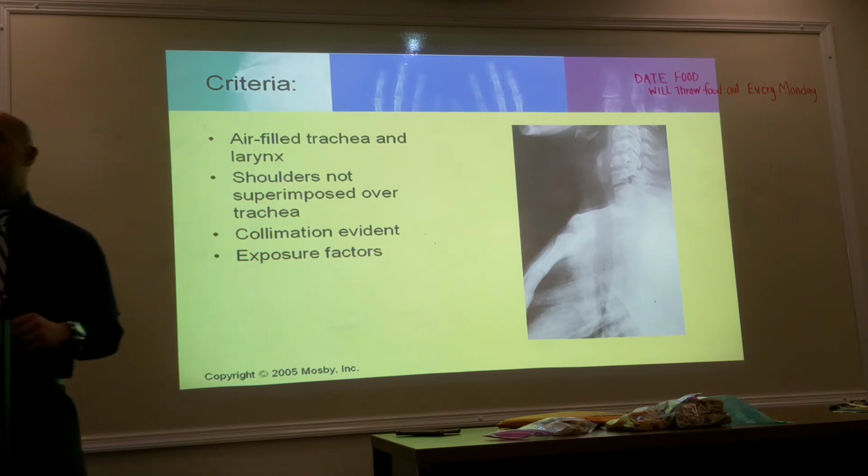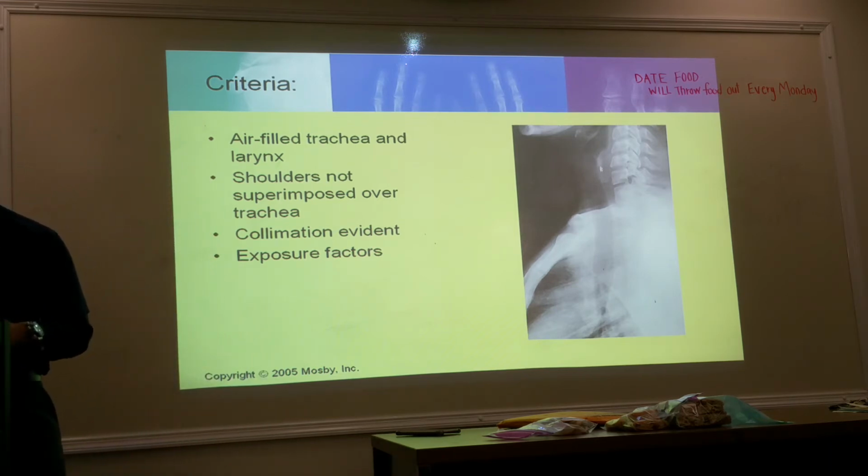Can we see the upper respiratory tract? Isn't this it right here? If you fill up the tract appropriately, you will see the upper margin of the respiratory tract. What's behind that? Esophagus. Trachea anterior, esophagus posterior.